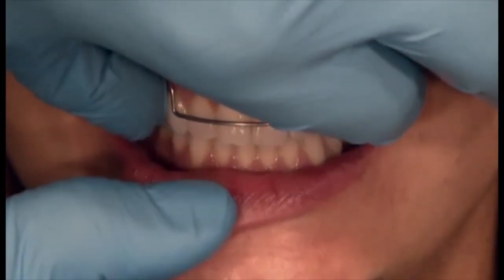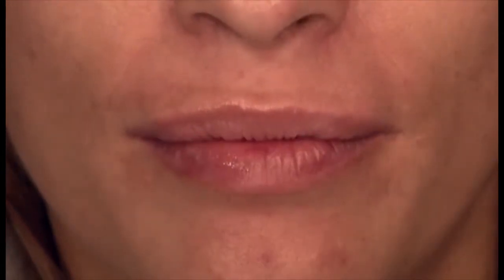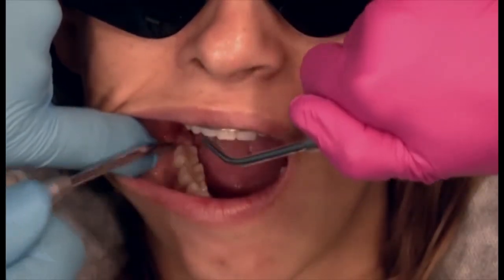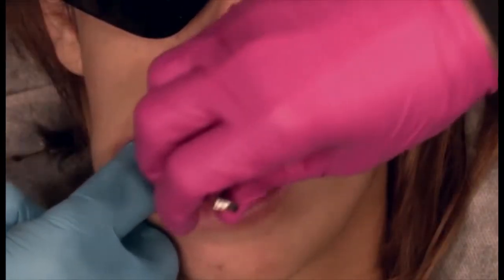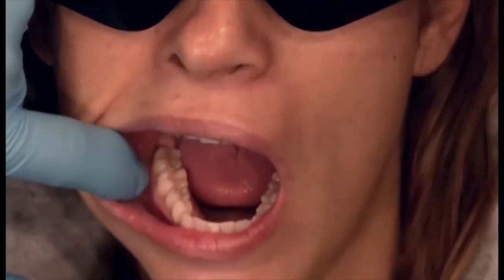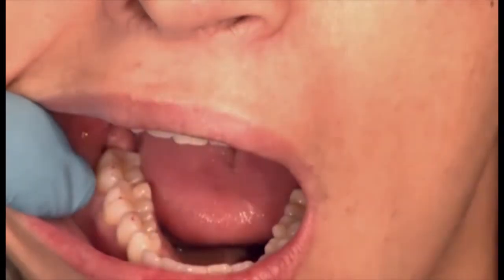Tap up and down. Do you feel contact now? Yes. Where do you feel the contact? On my right. On the right side again. Again, just like it was when we were trying to do the equilibration, it seemed to be on the right side for quite a long time before the left side came into contact. Go ahead and tap up and down. Okay. We already have a few contacts on the right side.